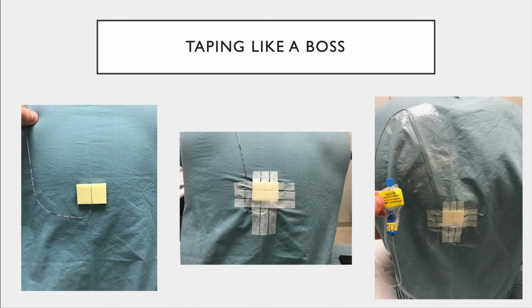So now you have the epidural catheter in place. How do you secure it? So this is one way to do it, and I found this works quite well. That sticker that I was mentioning in the epidural kit is actually a little sponge with a little slit down the middle that you can place. If your epidural is, say, coming out here at the top, you can place this little pad just below it. You can run the epidural catheter through this little slit, have it come out the bottom. You want to have this being held up in the air so it doesn't fall down and get contaminated.